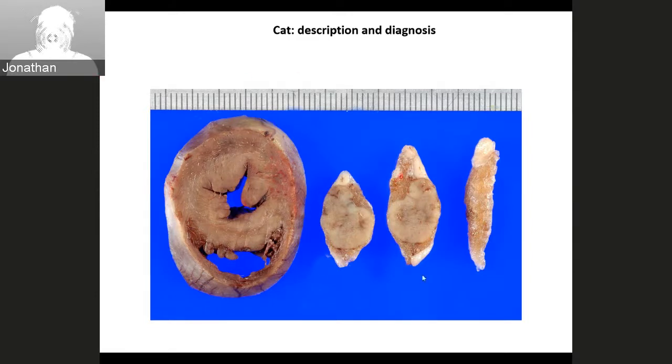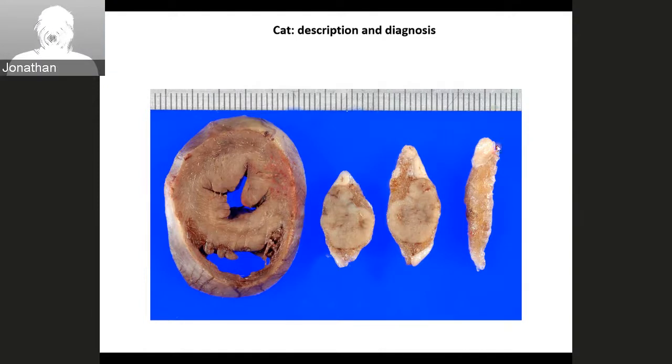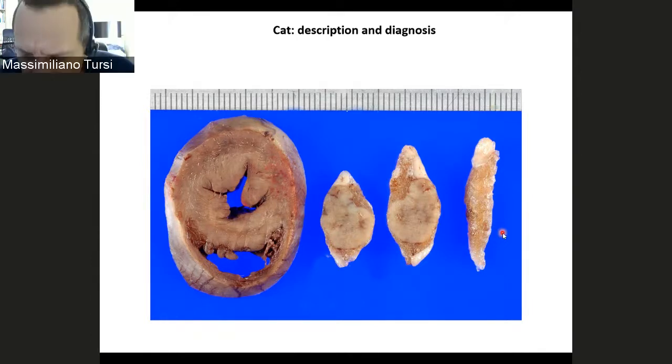I'm sorry, do you recognize this organ? Because that's the contralateral with a lesion, but that's normal. Well, is that an adrenal? Could it be an adrenal? It looks big, though. No, for an adrenal gland you have to see cortex and medulla.